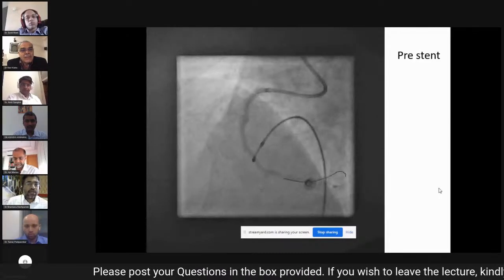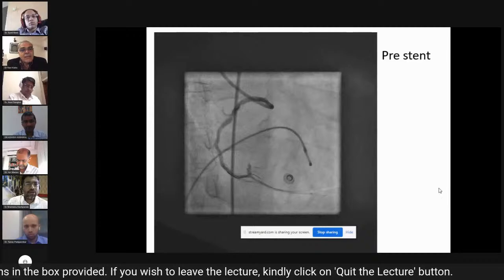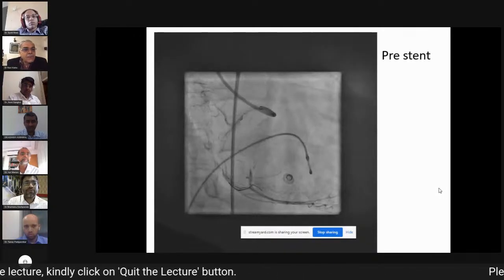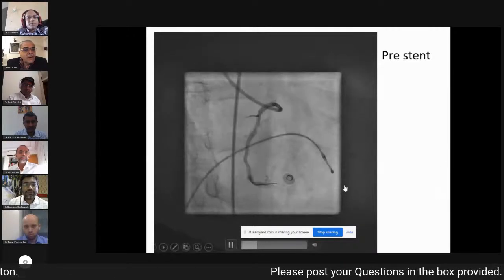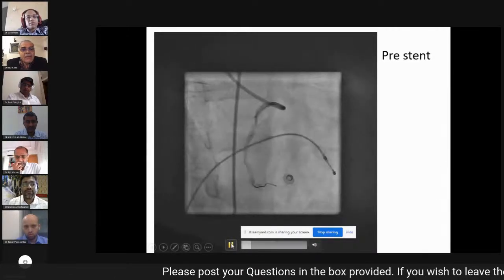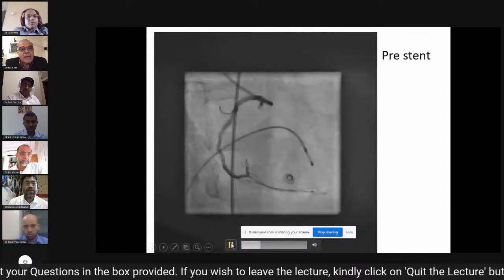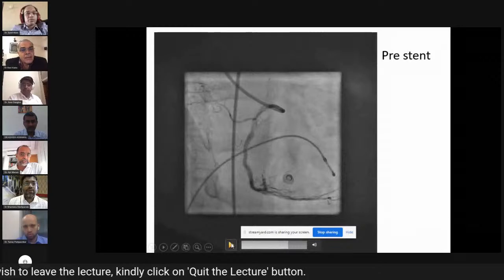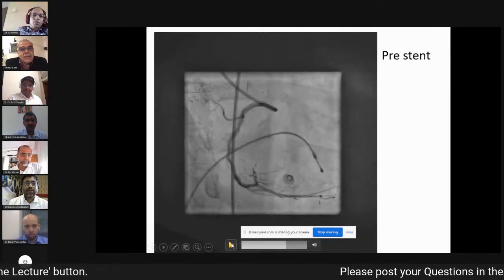One sec, Ashish. Do you need to post dilate even after IVL balloon, Dr. Menon or Dr. Kalra? IVL, I have very limited experience. Ajit, IVL normally you don't require to post dilate, because what you're getting with an IVL is preparation of the bed and improving the compliance of the bed by cracking the calcium. So you're not going to gain anything more by going at high pressure with another balloon.